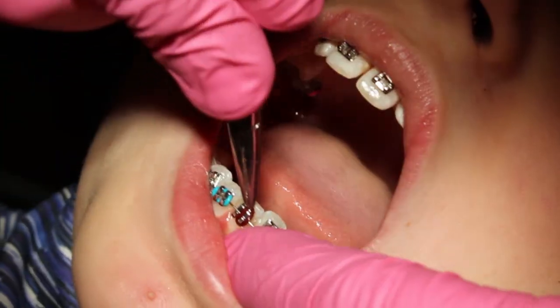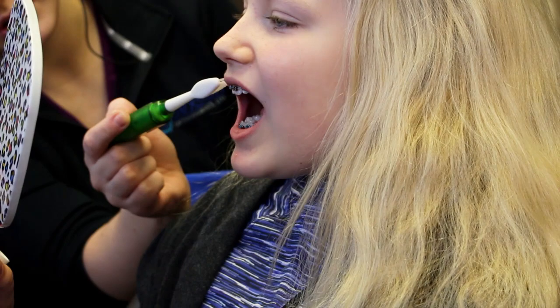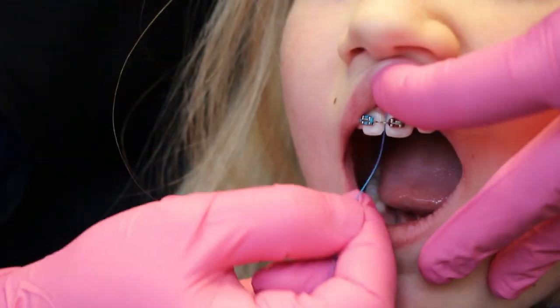My favorite part of the appointment was when I got to choose the collars. Then they go over the instructions on how to take care of their braces — as far as brushing, flossing, what foods to eat, and what foods to avoid.